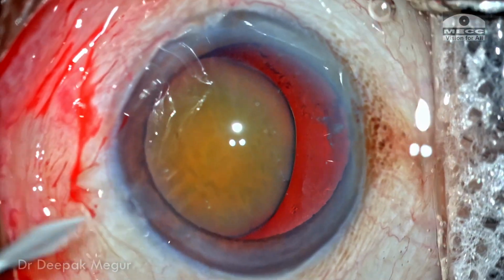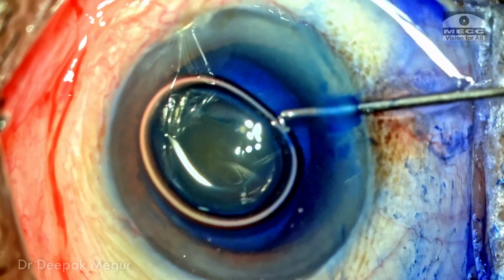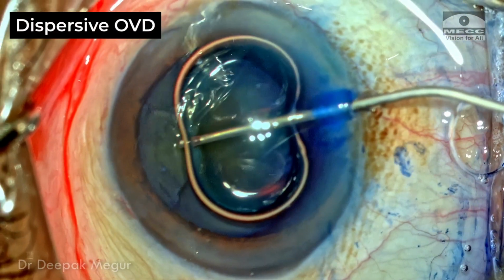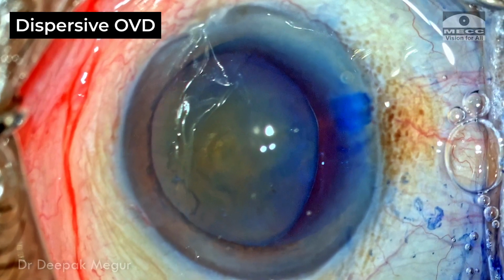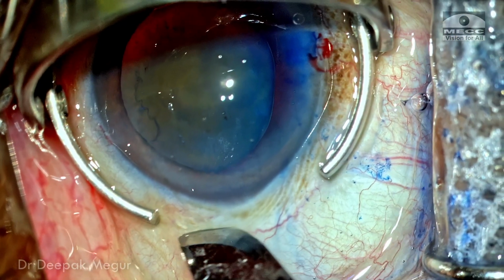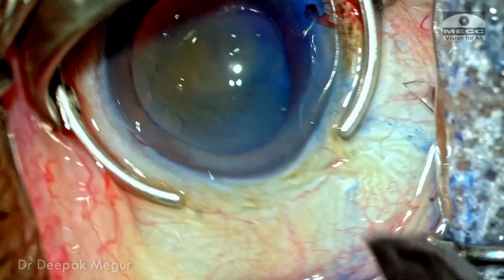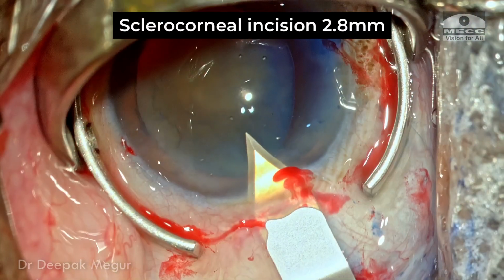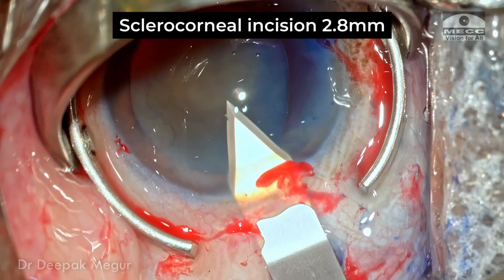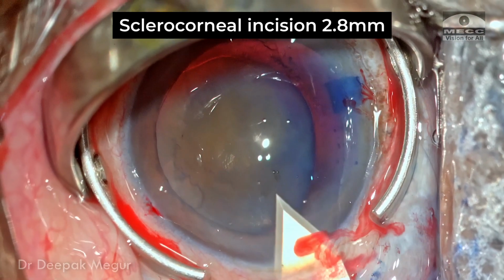The side ports are made, the anterior capsule is stained with trypan blue, and the anterior chamber is pressurized with a dispersive OVD which is going to protect the corneal endothelium. And since I have kept the option of manual extraction of the nucleus and the iris clip lens, I'm consciously making a sclerocorneal incision. The incision is about 1.5 mm behind the limbus, and it goes all the way up to 1.5 mm into the cornea.